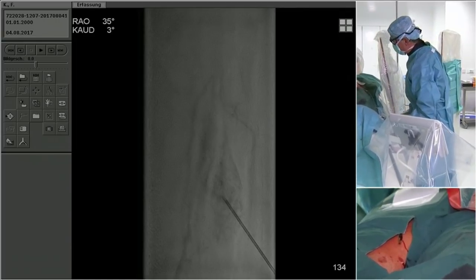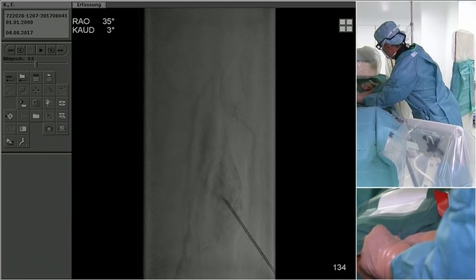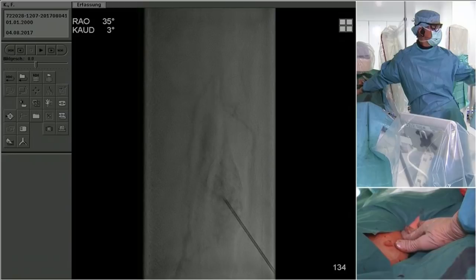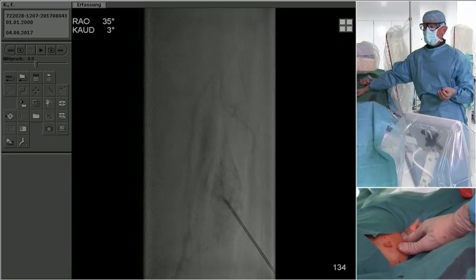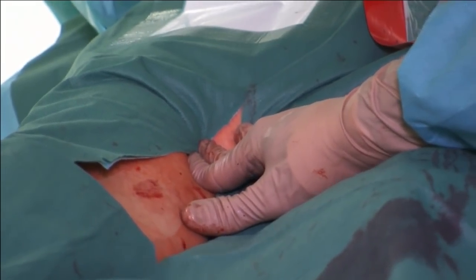Yeah, actually not really. I could go a little lower. 7 centimeters. It's also refreshing to see a little bit. Yeah, sorry. It doesn't really show you the ease of this technique here now.